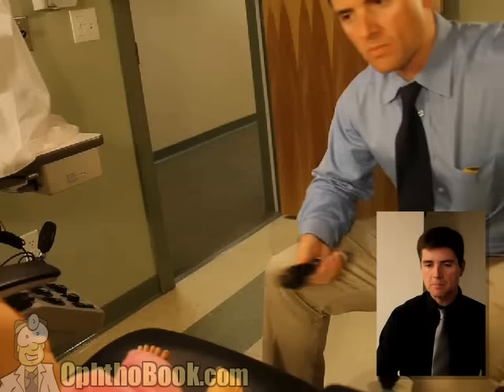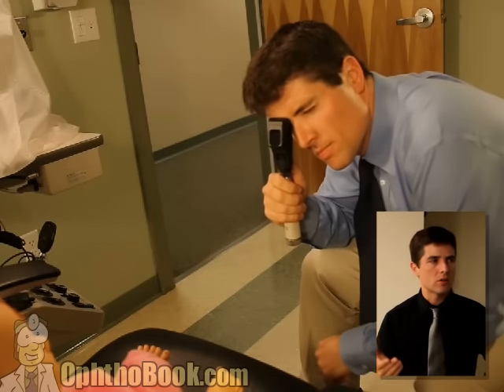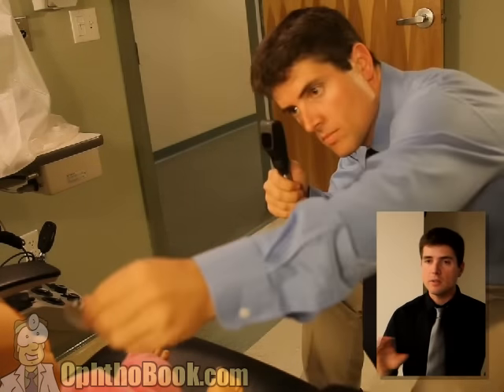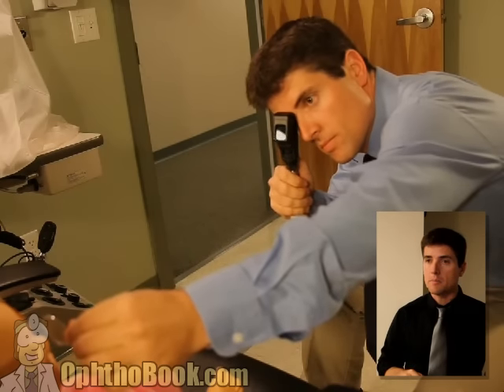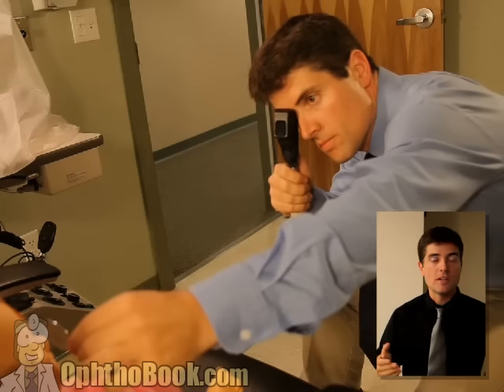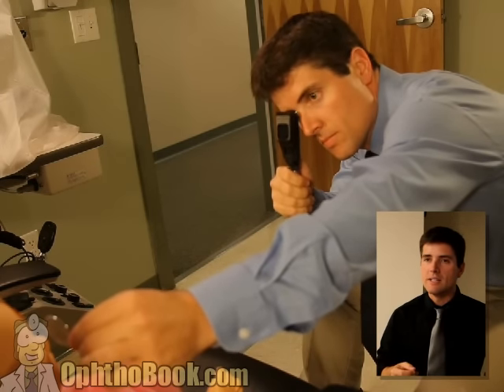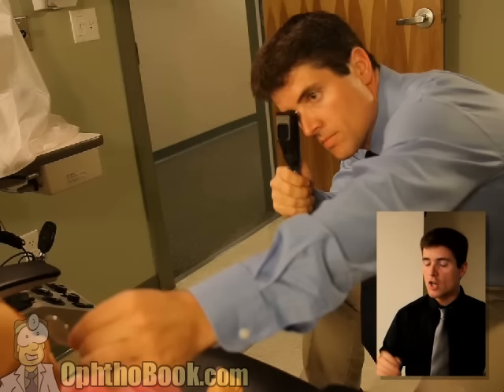The difficulty with retinoscopy in general is that it is hard to teach. When people describe things to you, it's very hard to visualize, especially if you've never seen it before. You get absolutely no feedback — at least with a phoropter, patients can say 'I can see one better than two.' With retinoscopy, you get nothing. All you're looking at is the reflex in the back of the eye, and by holding different lenses in front, you're trying to estimate the glasses prescription. So it's challenging.